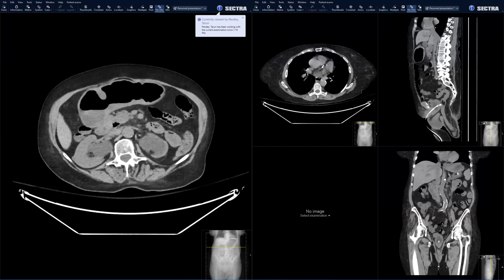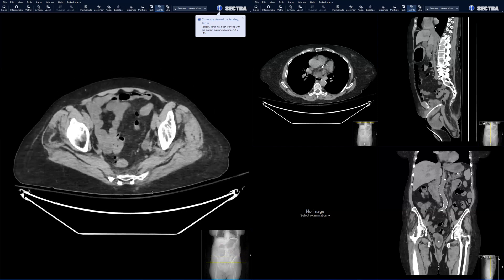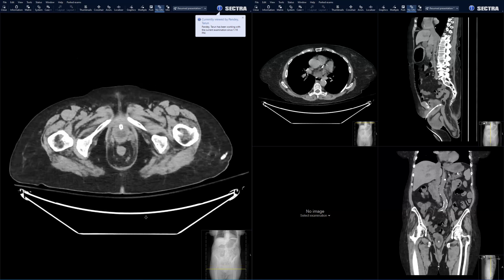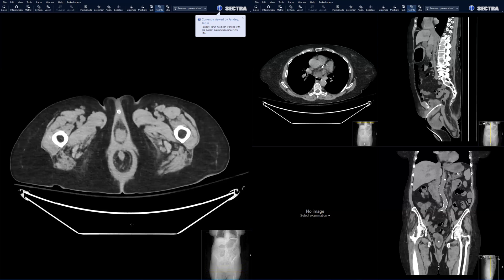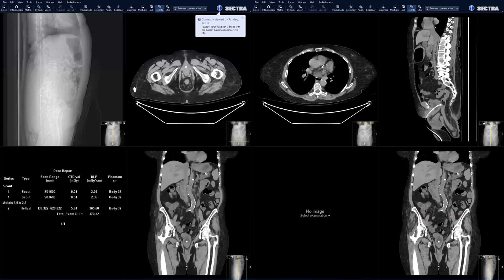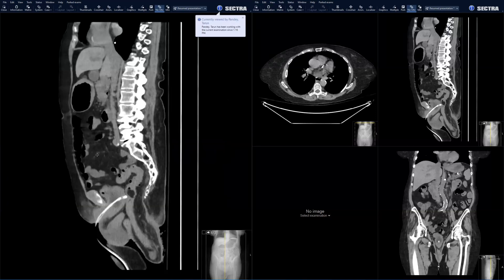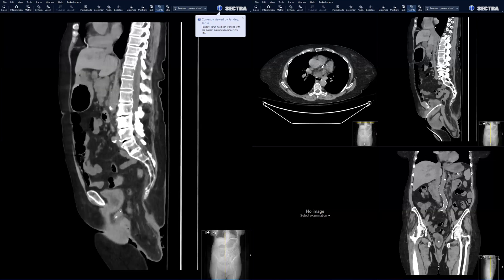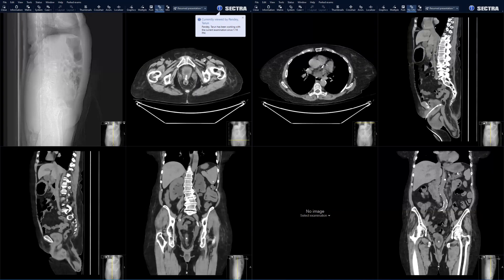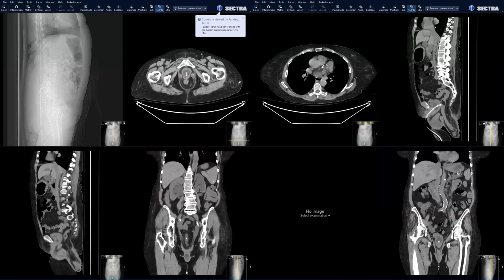71-year-old female. It's a non-contrasted scan. The ureter looks like it's inserting on the vagina — massive prolapse. Basically there is massive prolapse as you can see here. The bilateral ureters are dilated and there's hydronephrosis, and the reason for this hydronephrosis is just this prolapse.